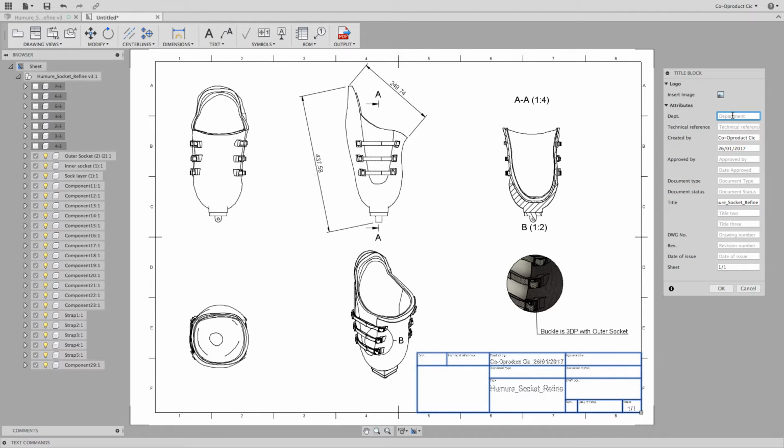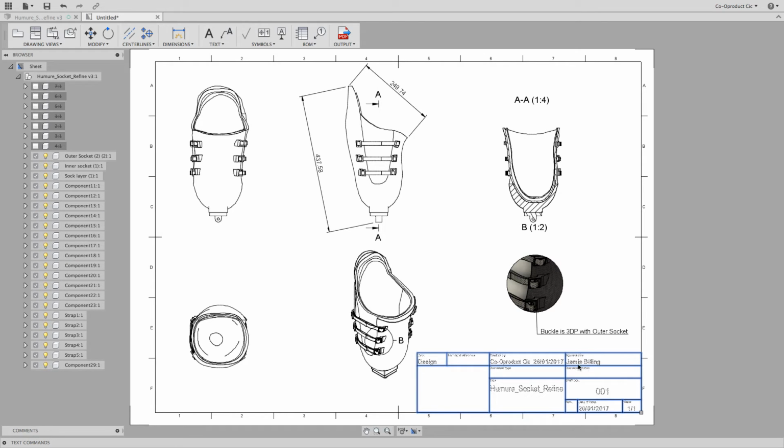We can make numerous changes to the title block. In Department, we could enter Design, for example. We could enter who the drawing was approved by, and a drawing number. And we should enter the date. And if we click OK to close the window, we can see the updated information in the title block on the drawing sheet. In the toolbar, we can also add symbols and a bill of materials.